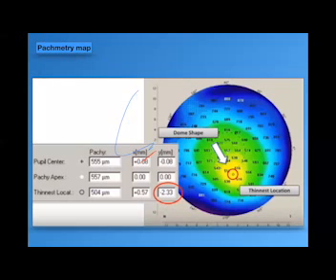If I have a patient with a thin cornea, around 450, and a refractive error, for example -2 diopter in one eye and -1.5 diopter in the other eye, the patient needs refractive surgery and wants to remove the glasses.